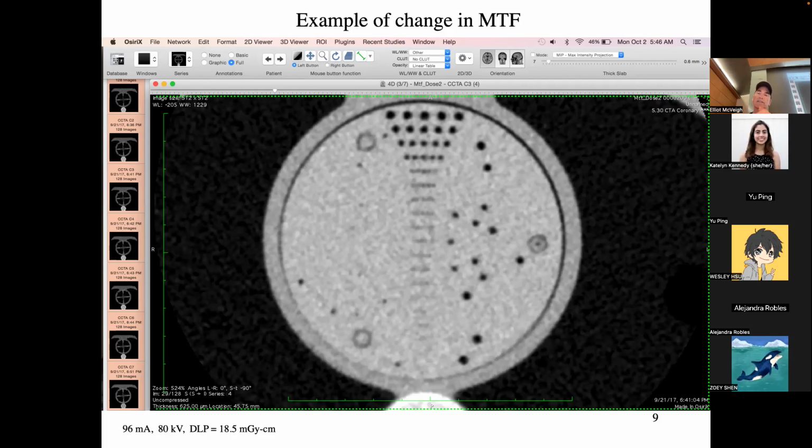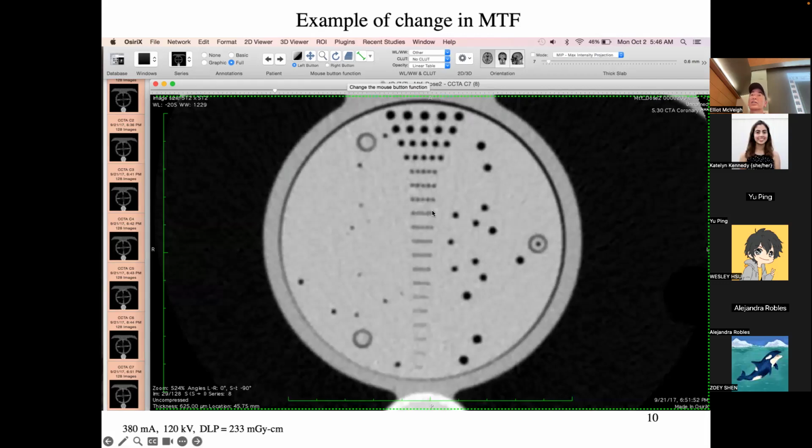Okay, so the question is, we got two things changing here. One is the number of photons, changing the basic signal to noise of the background detector. And the other is the spatial frequency of the input. Did I change that? No, I didn't change that. That's fixed by this phantom. So the spatial frequency is represented by the spacing between these, let me do this one, between these circles. As they come closer together, I need higher spatial frequency to resolve that picture, right? So that's a kind of a fixed thing in the background in your phantom. And then you just look down the phantom and say, where does this signal, which is an oscillating signal, turn into just a bar, right? That's an average, right?